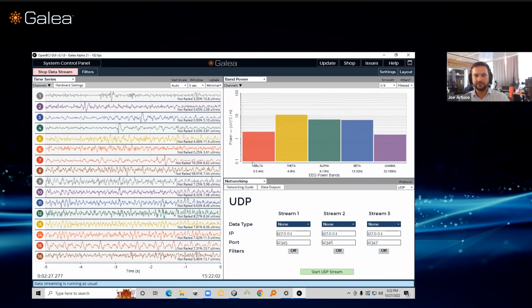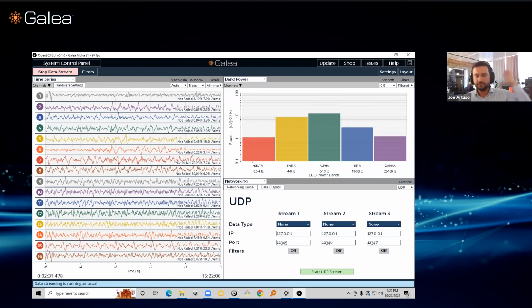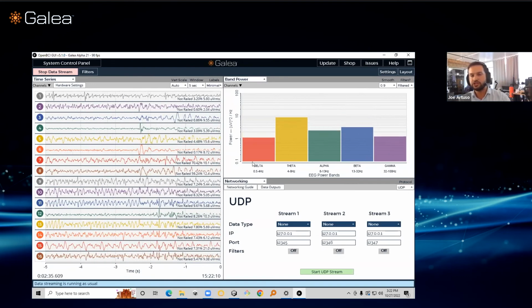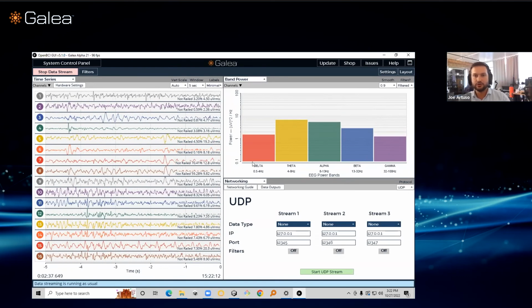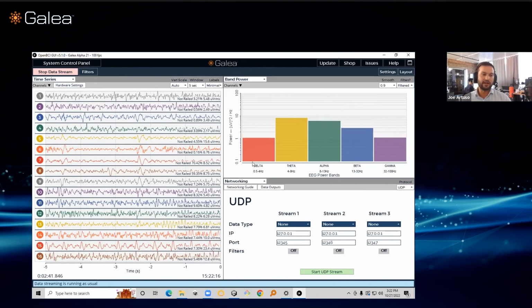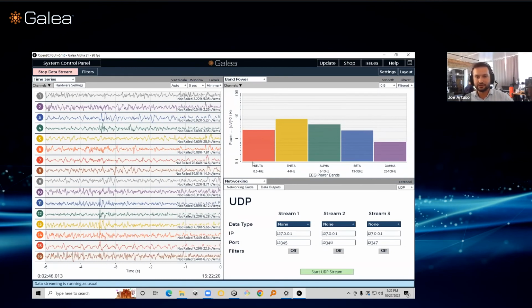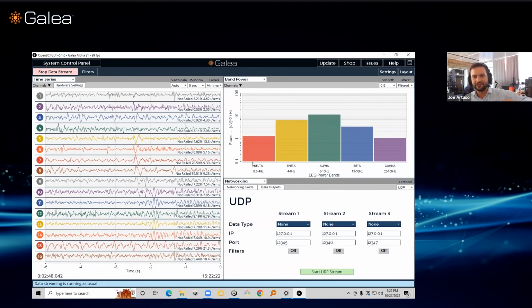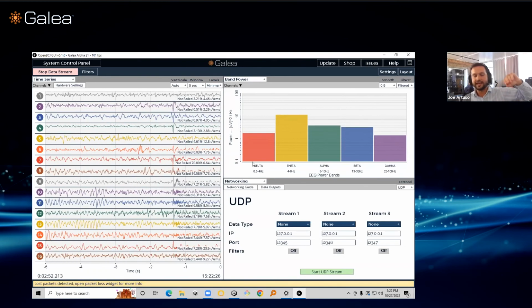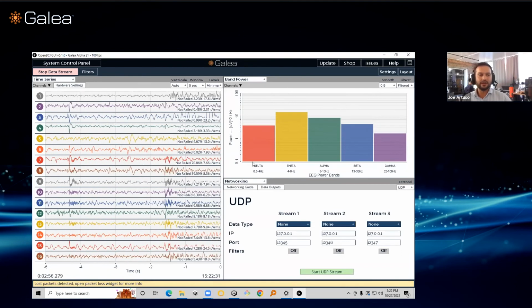For a gaming specific application, we may find that all of the EEG sensors aren't necessary, or I just want to hone in on PPG and EDA as my two modalities, and then a much simpler version with a BOM cost in the hundreds or dozens of dollars if you're operating at Facebook scale or someone else's. It will get minimized down and the cost brought way down.